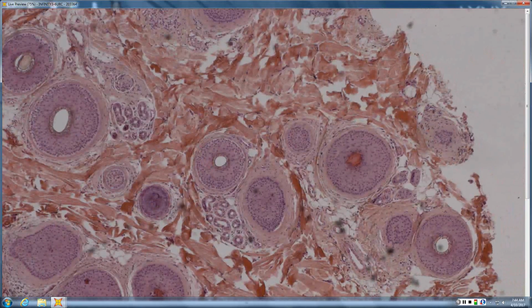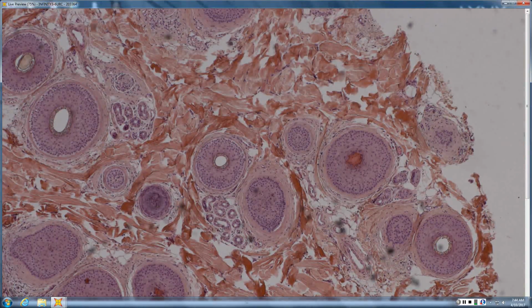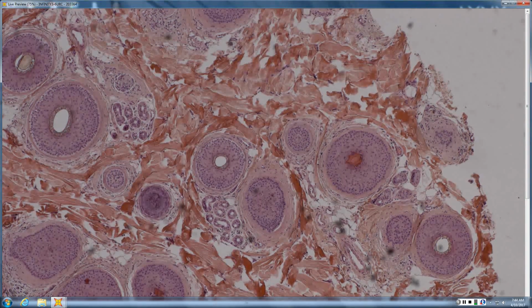The pigment casts within the hair channel you can see in any of the 3: trichotillomania, AA, syphilis. Pigment down in the fibrous tract, so not in the hair canal but in the fibrous tract, that's alopecia areata or syphilis. In the canal can be alopecia areata, syphilis, or trichotillomania. Normal inner root sheath keratin is kind of dull pink like this. The really bright red keratin is characteristic for trichotillomania.